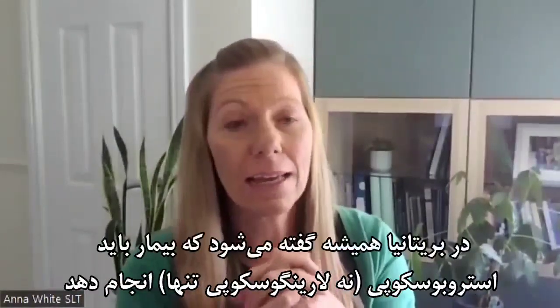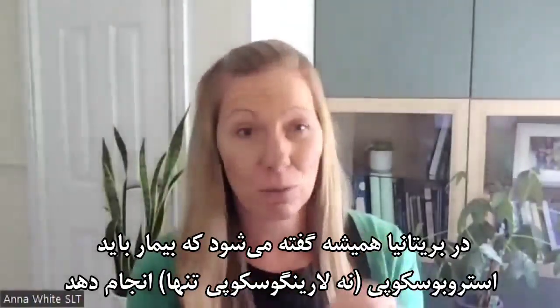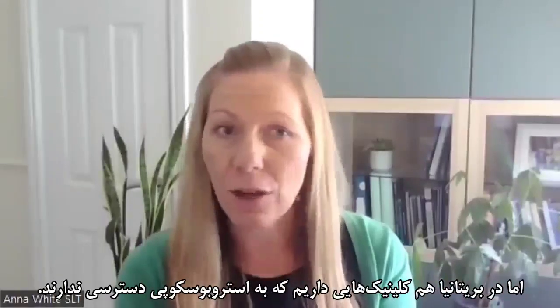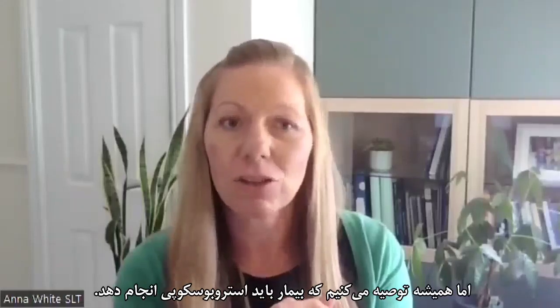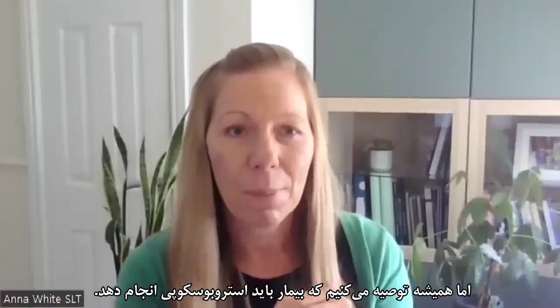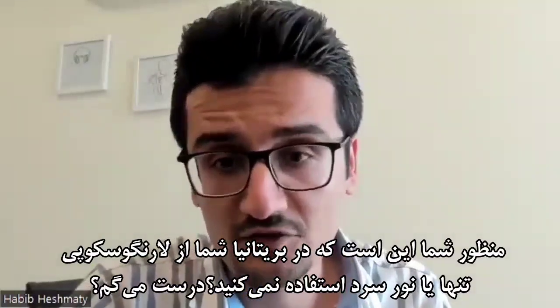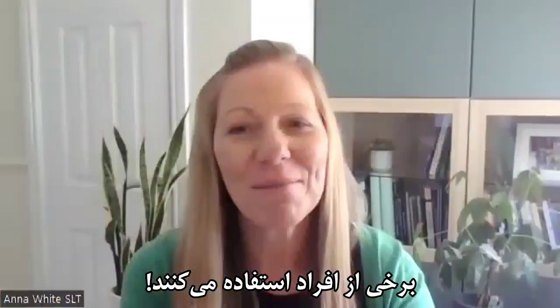So in the UK, we always say that patients really should have stroboscopy. They don't always. We have clinics in the UK that don't have access to it, but we would always recommend it. You mean in Britain you don't use cold light laryngoscopy? Some people do.